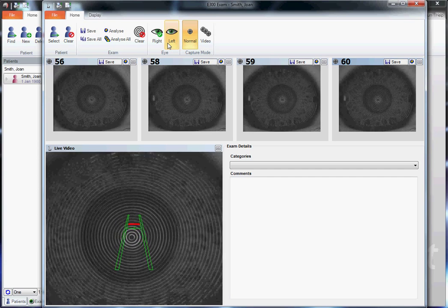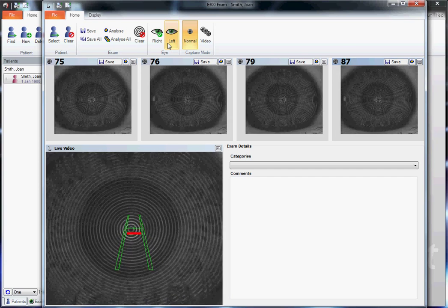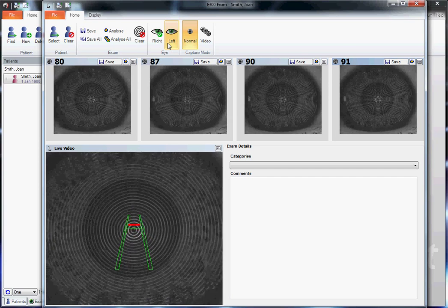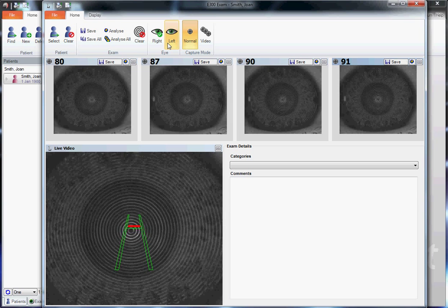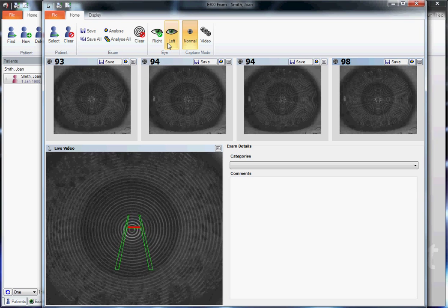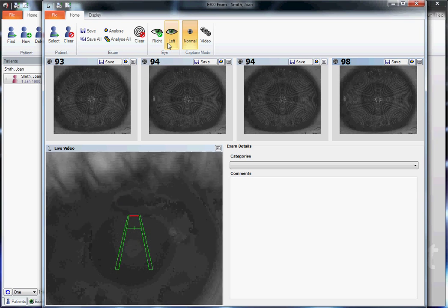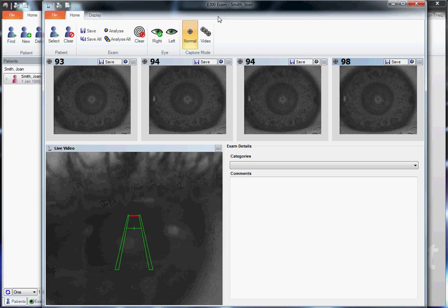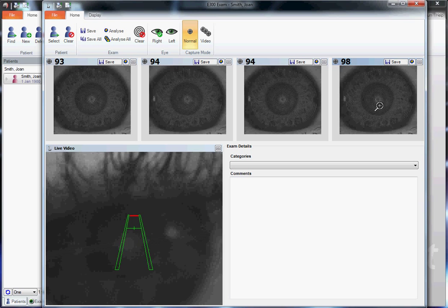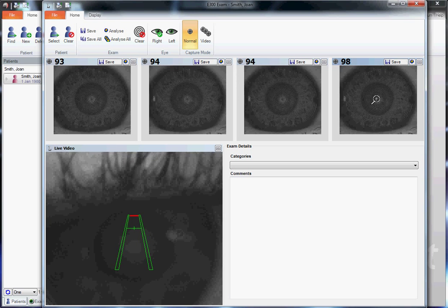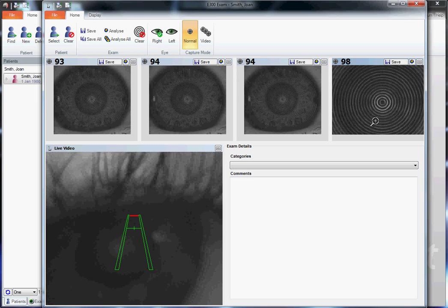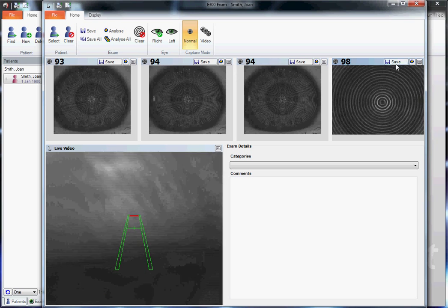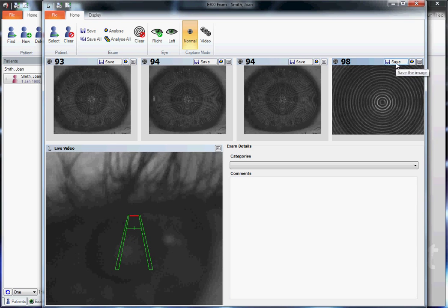And a blink. And a blink again. Good. Now we have an image over 95%. Zooming in, we see the rings look parallel and even. Let's click save.